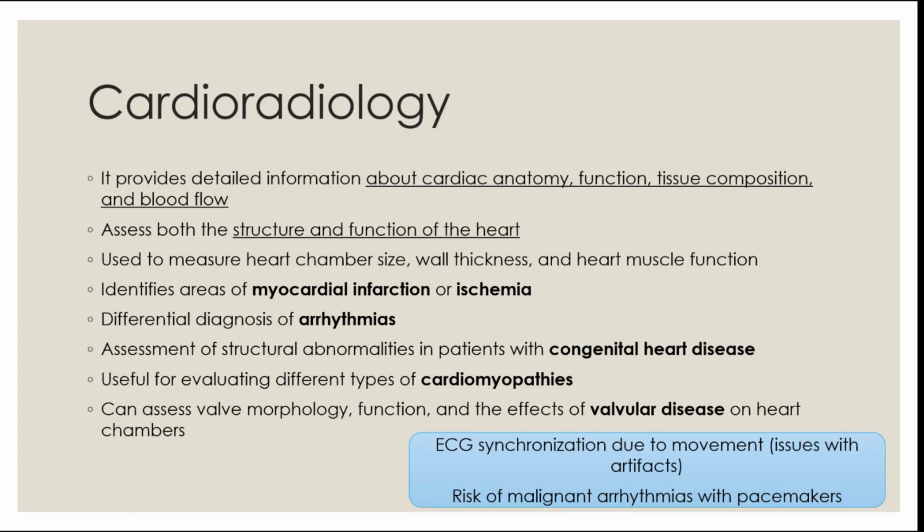You can differentiate between arrhythmias. You can easily see the different types of cardiomyopathies, all of the cardiomyopathies, and also congenital heart diseases, and also evaluate the valves and any defects with the valves.